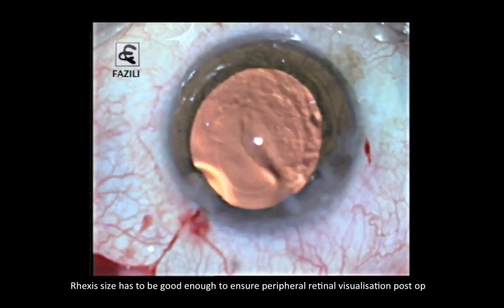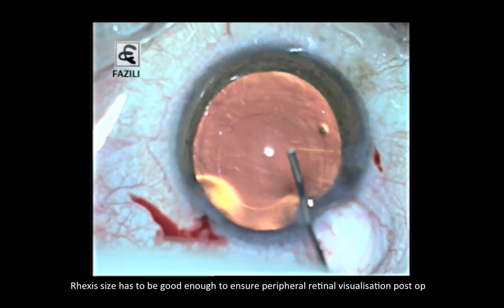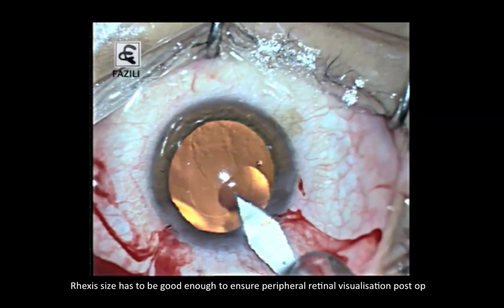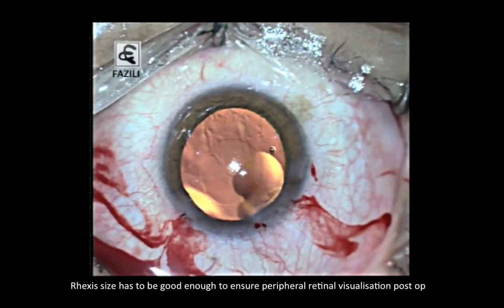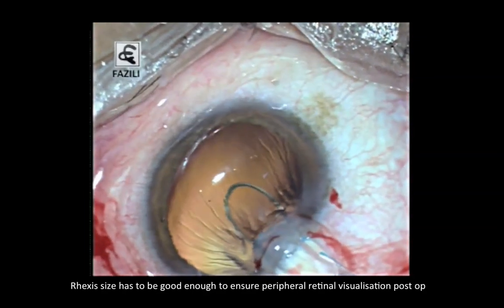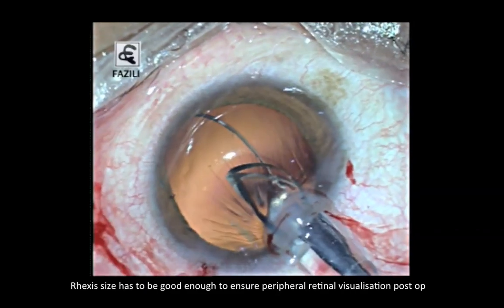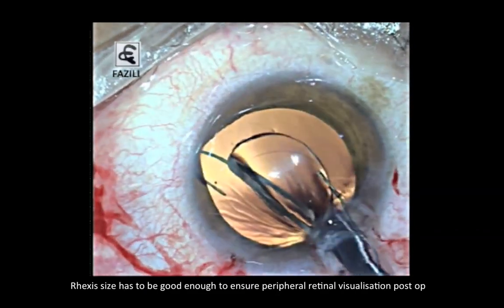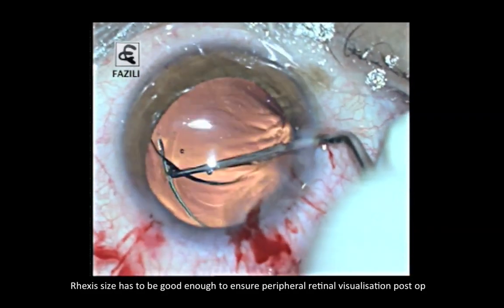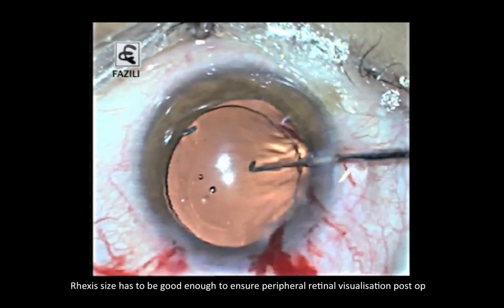So after you do that, you can see here there's a 3-piece lens which I'm going to implant. Though the rexis size being small might actually give a little difficulty implanting the lens, because 3-piece lenses are slightly bulkier and more difficult to put in through smaller rexes. But again, there can always be a struggle through a small rexis. So the small rexis is not just an issue of whether you are able to do a safe phacoemulsification or not. It's also a matter of with what ease you can implant.